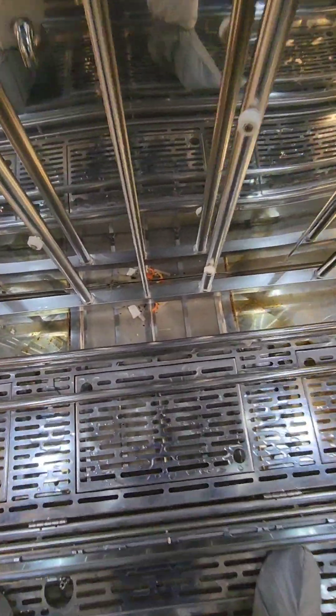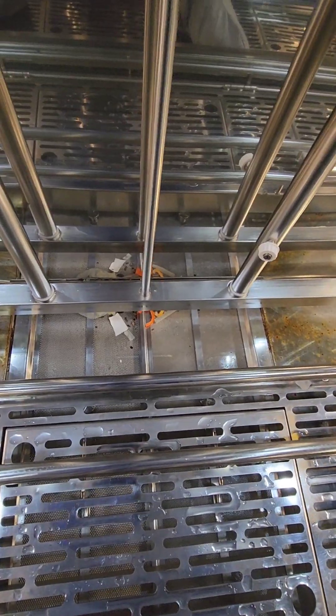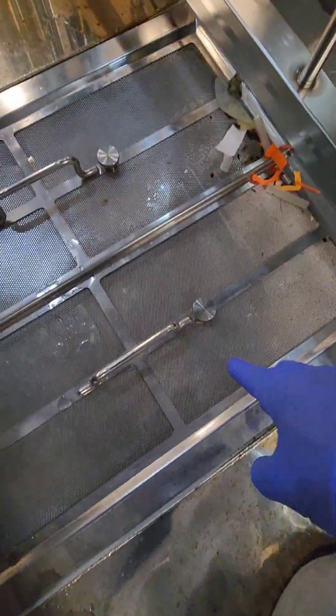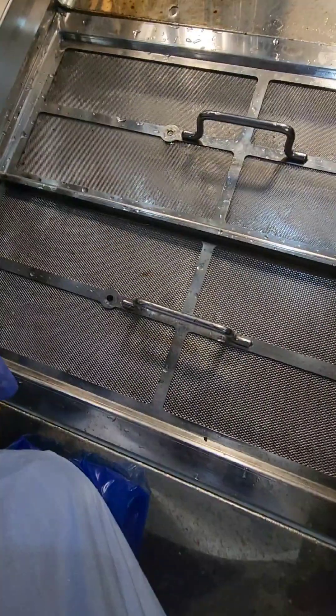As you can see, our drain screens are pretty filthy. We're going to pull this floor plate up, access our screens, remove the two thumb screws, and take them over to the sink and clean them out really well.